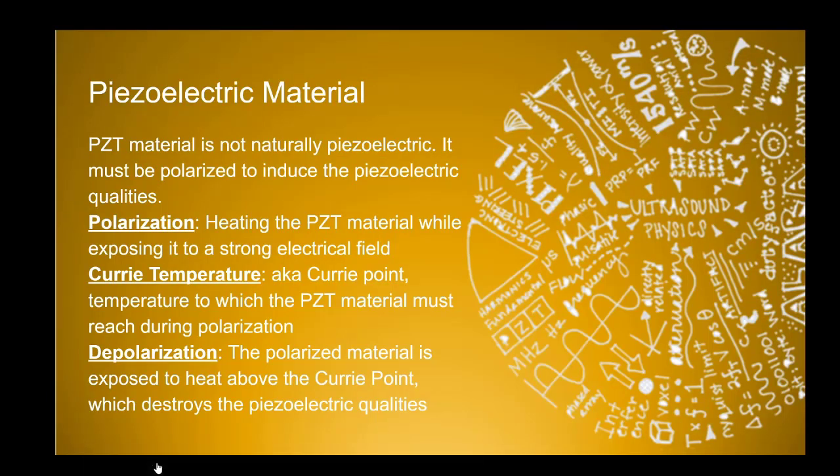All right, getting on to some other material that we just need to talk about a little bit more is the piezoelectric material. So we learned already that piezoelectric material is a man-made material typically for our transducers, and that it has this property, and when it has electricity applied to it, it'll create a sound wave, and then reverse is when that sound wave comes back, it'll create a voltage.